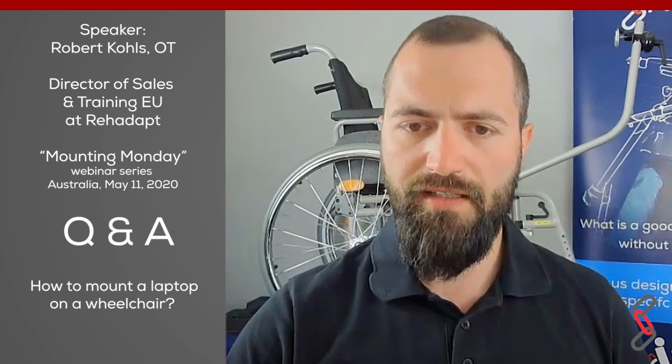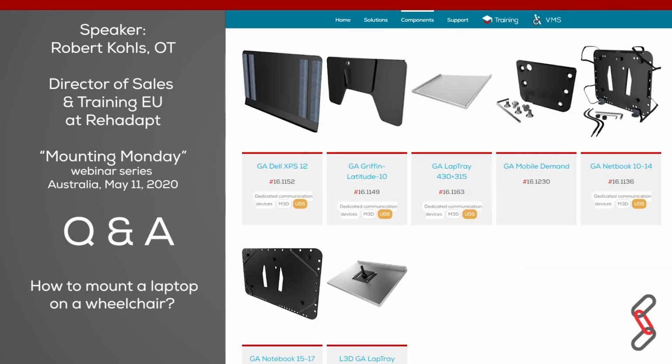When you go onto rehadapt.com, then to components, you will find the area of adapters for smartphones and tablets, and there you find it below. I can share my screen with you again. There you will find all different kinds of laptop adapter plates.